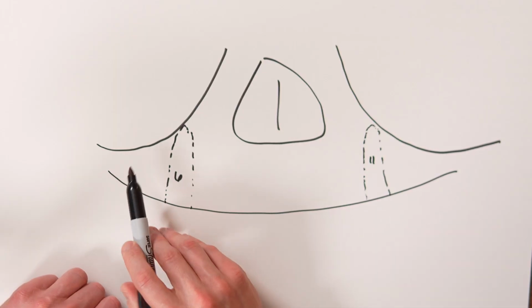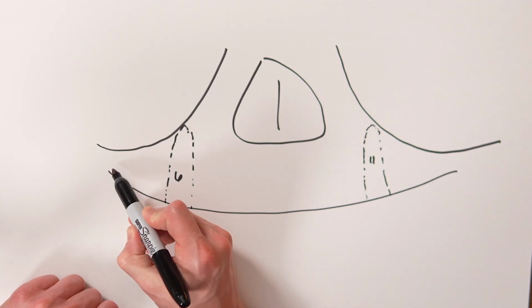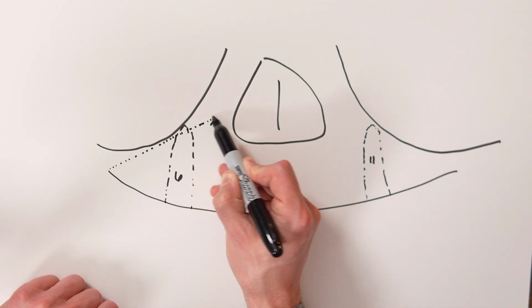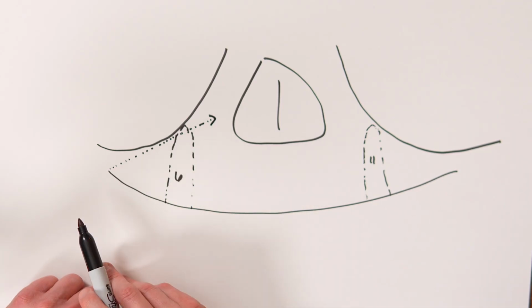And so again, what you can do intraoperatively is if you have a canine socket and you're trying to maximize your spread, maybe it's a pneumatized sinus case, you can really stretch that implant position really far back. And as long as you see that implant drill pass through the tip of that canine apex socket, you know that you're not in the sinus.